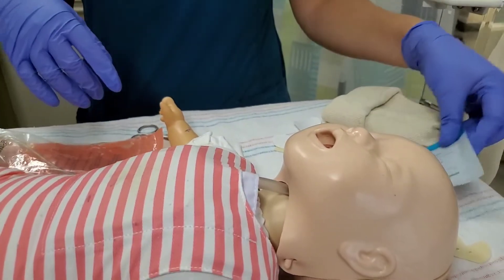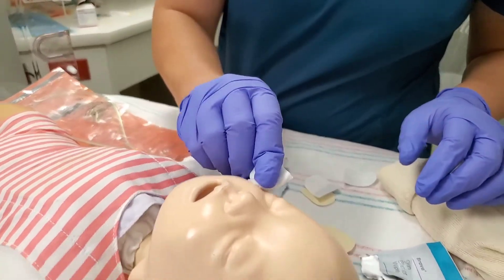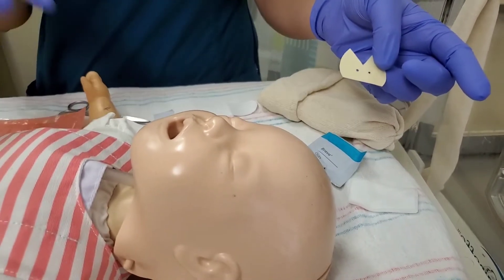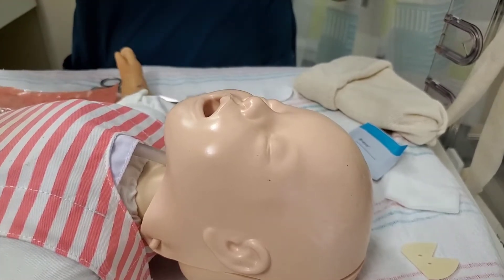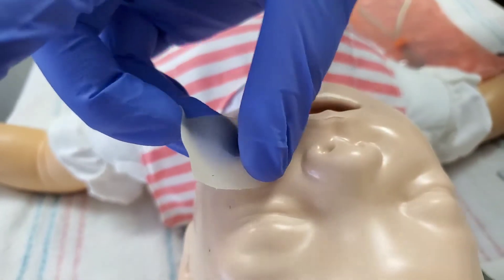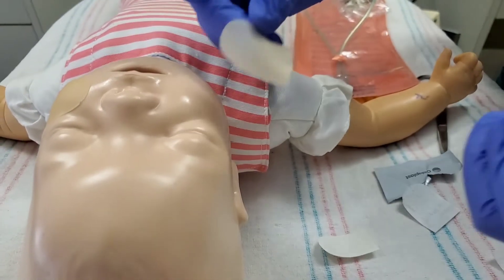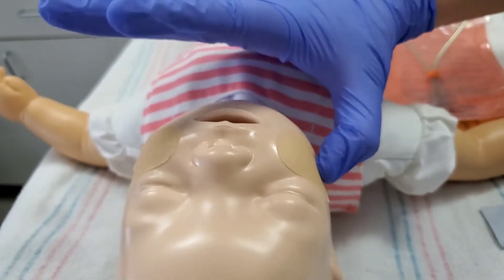First thing we're going to clean off the skin and then put our skin barrier. Make sure not to get it in the baby's eyes. You also want to apply the skin barrier to the nose so that the cannulaid will stay. The cannulaid serves a similar purpose to the chin strap — maintaining a closed system, a seal, so that the baby can get the full benefit of that CPAP. Let's apply our Duoderm cheek pads. You want to get it definitely underneath the eye, not in the eye, a little bit away from the nose so that it does not overlap with the cannulaid. Place it on there nice and flat, same with the other side. Try not to touch so much of the Duoderm with your gloves, because if it sticks to you it won't stick to the baby.